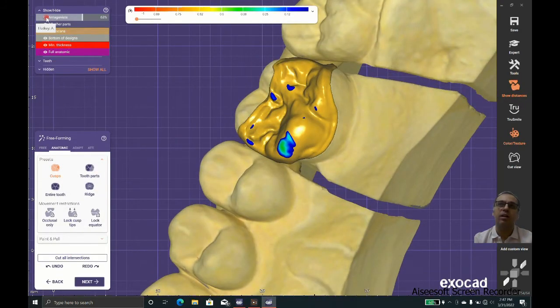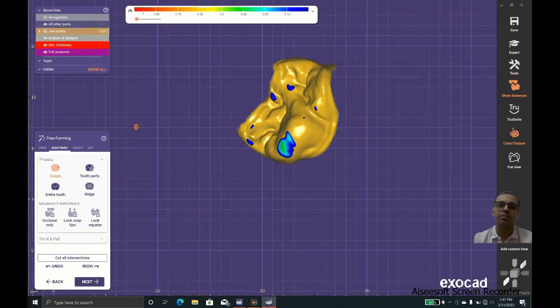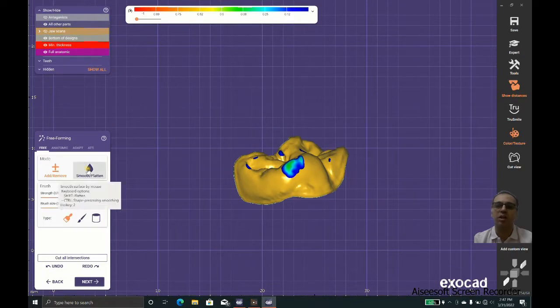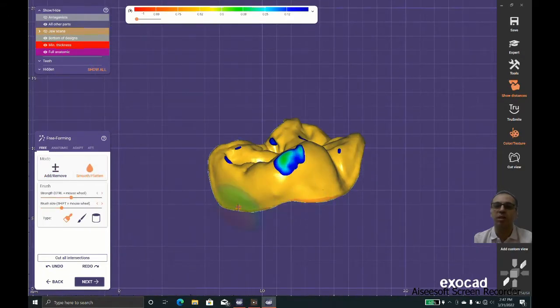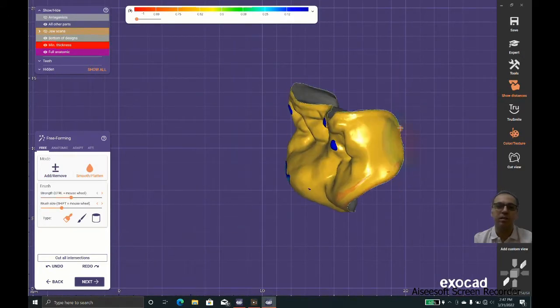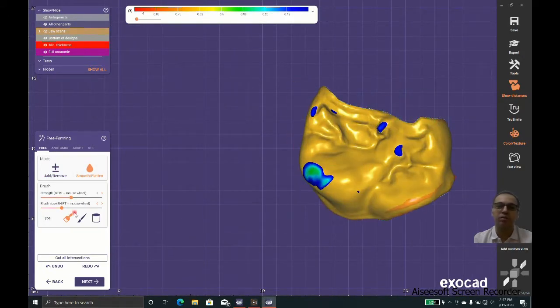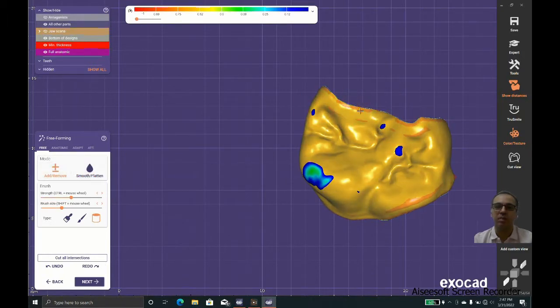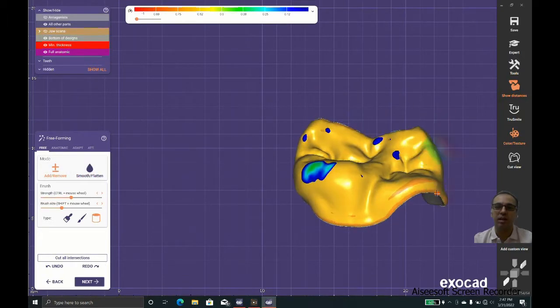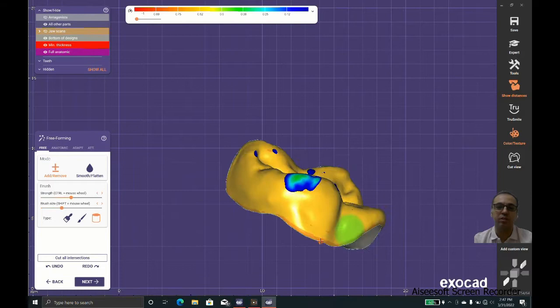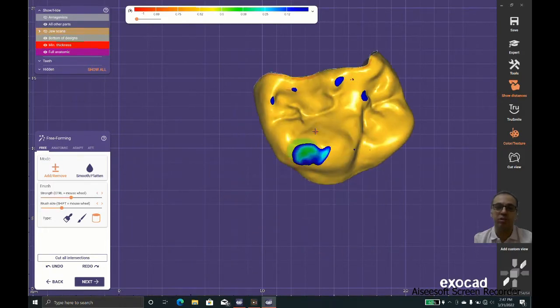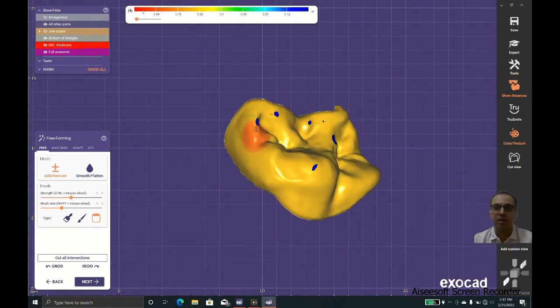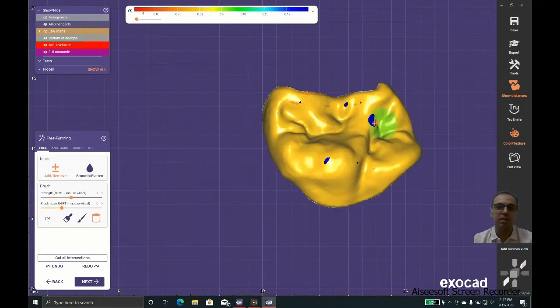Sometimes the marginal ridges are not in the proper place and they lead to food retention or some kind of problems that will fail the restoration earlier than it should be.